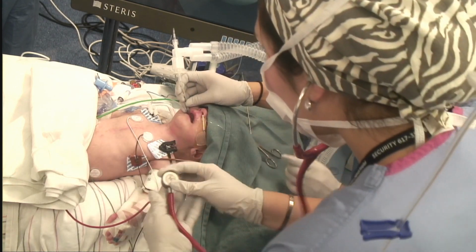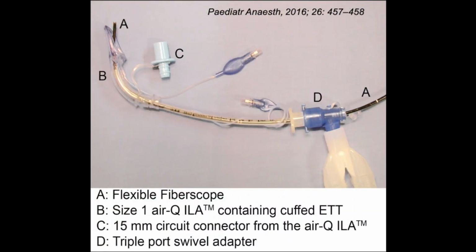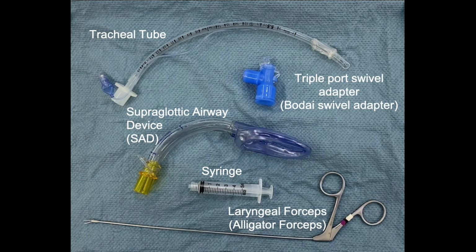Now that we better understand the equipment needed and the concepts involved, let's move on to an example of setting up and using this combination technique as narrated by Dr. Jamie Peyton with help from Dr. Bistra Vlassakova.